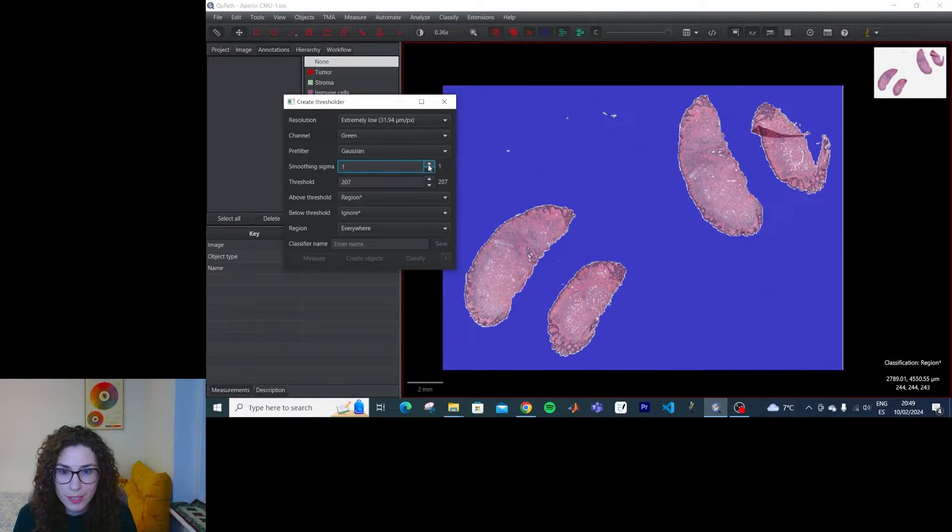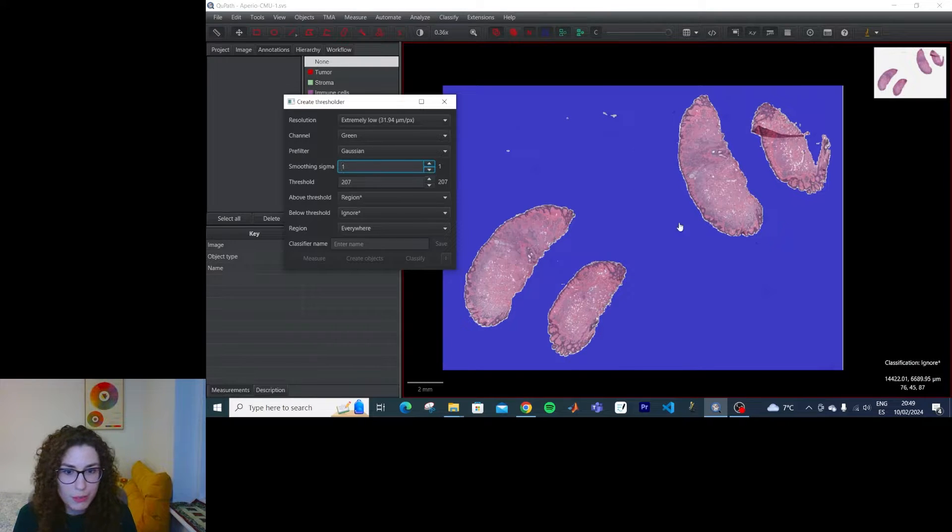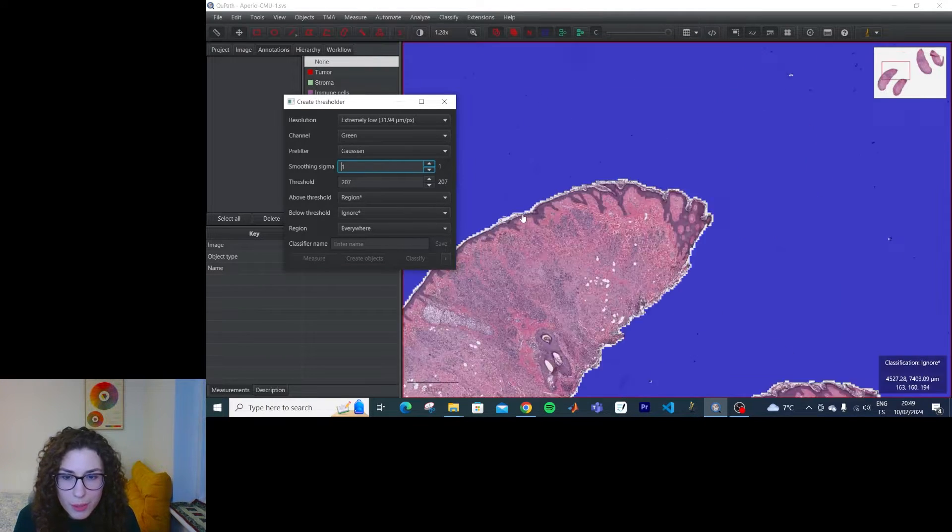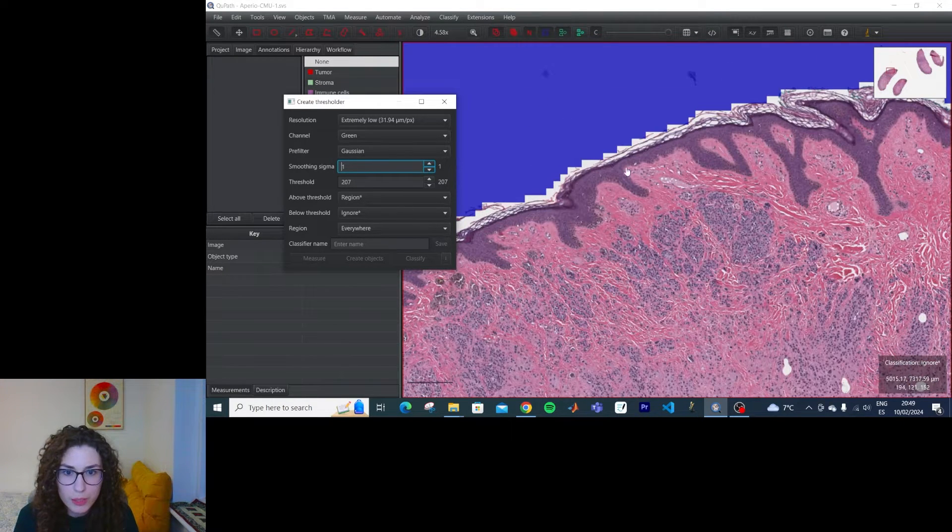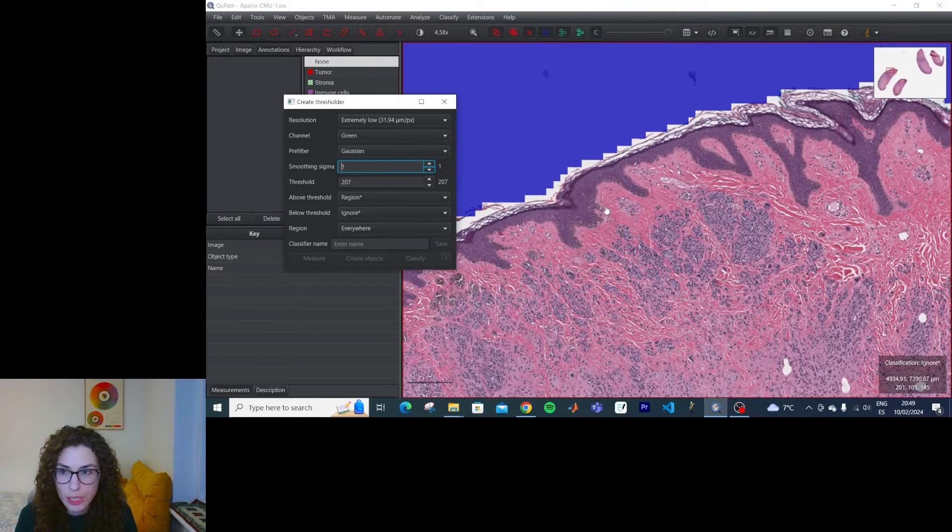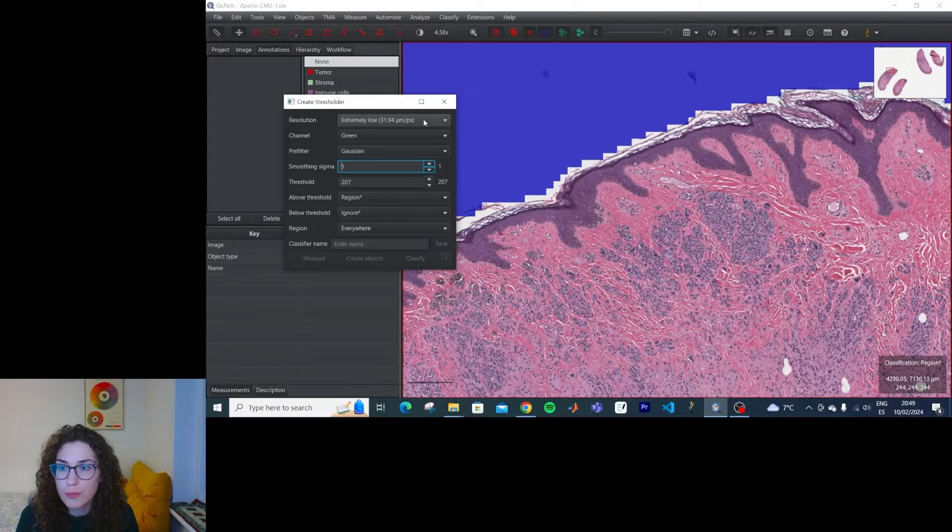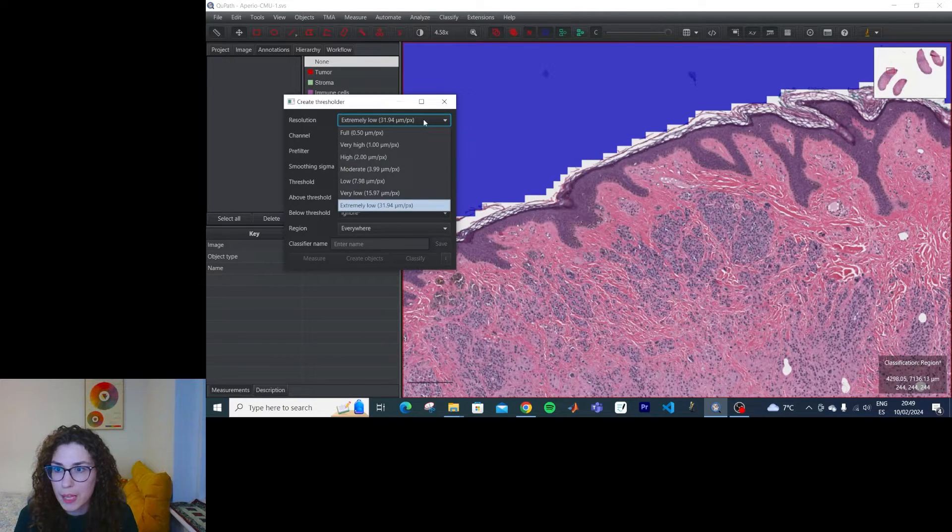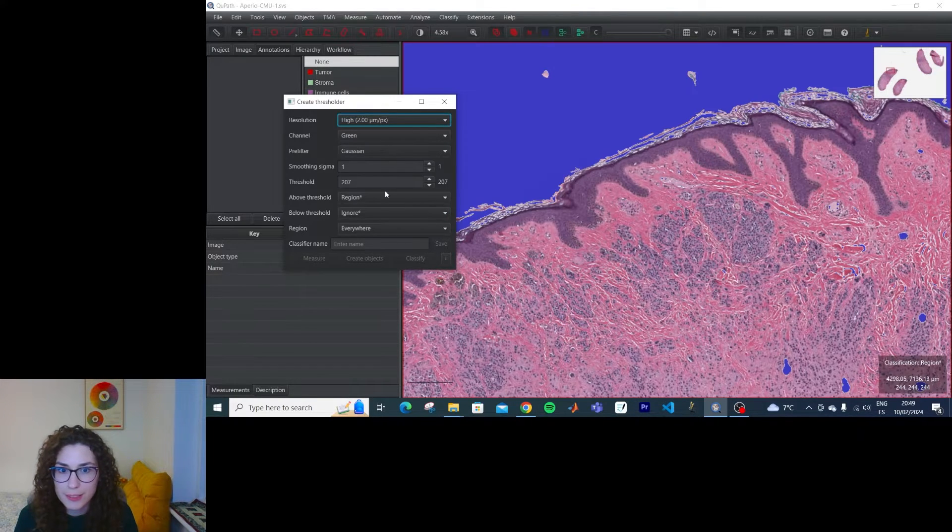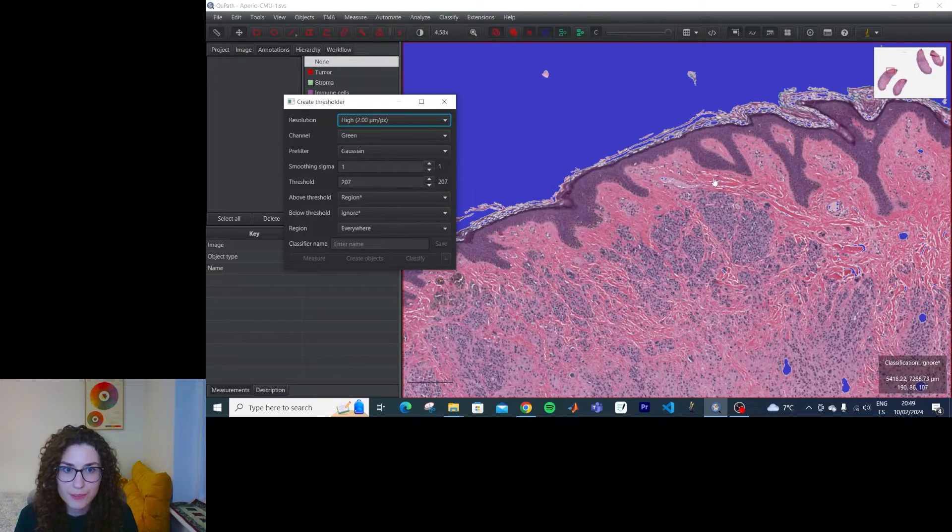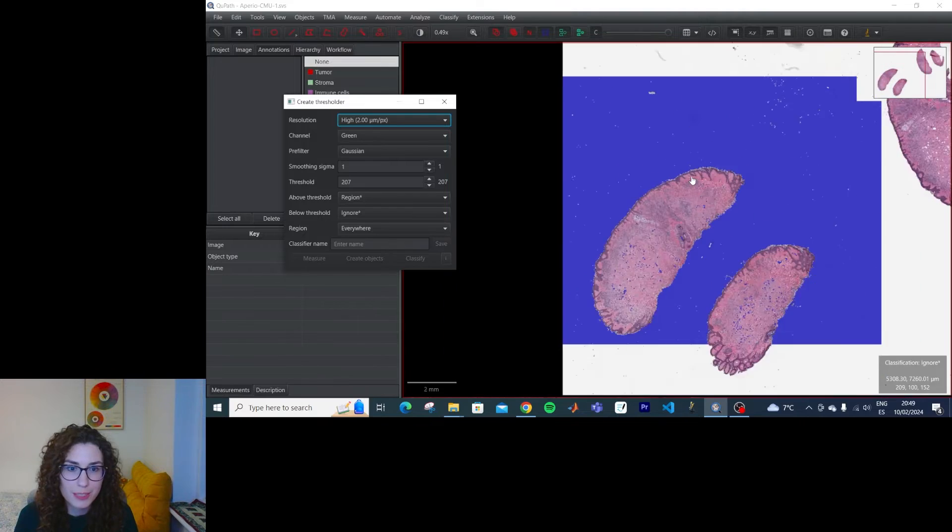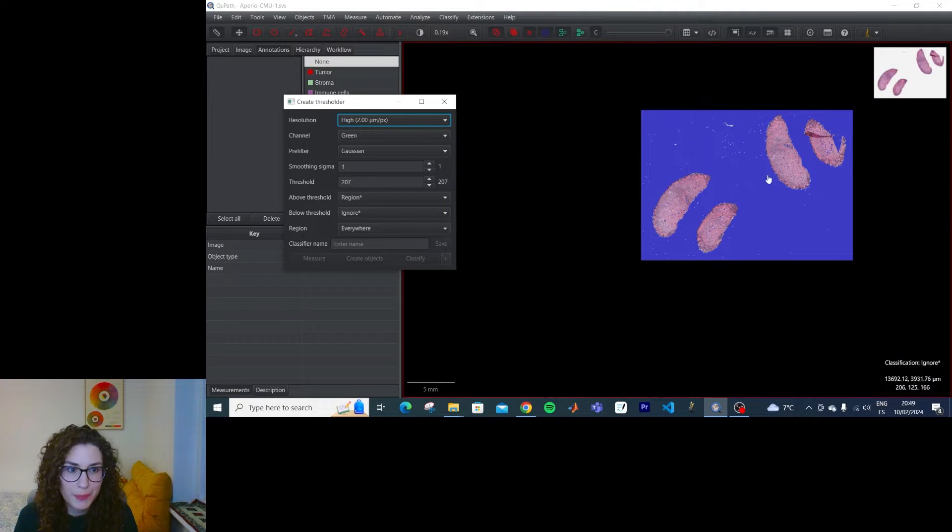If we do this, we get rid of a lot of bad stuff in the background, but we lose definition here. But what if I do this, and at the same time, I increase the resolution? Then it's much better.